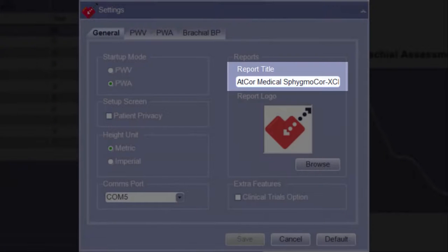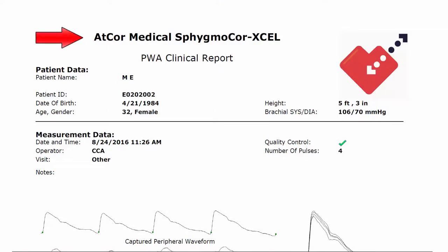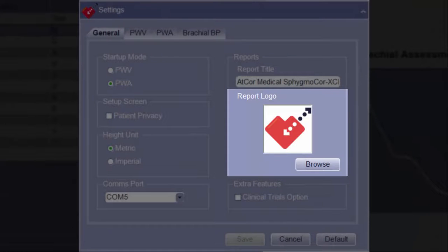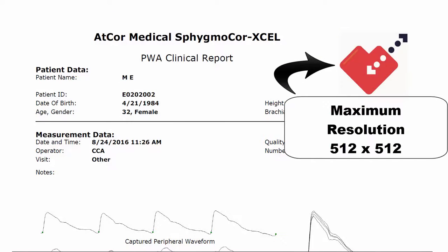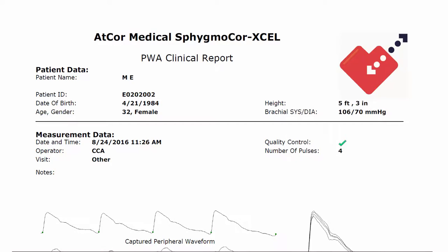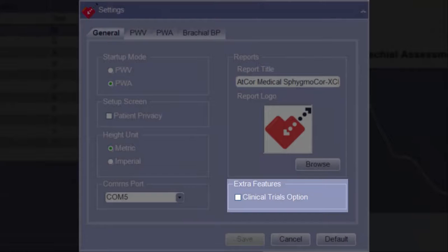Under the Reports section, the report title can be customized for printed patient reports. The title can be a maximum of 39 characters, including spaces. The Report Logo option allows for a customized logo to be placed on the top of printed reports. The maximum resolution for the logo is 512 by 512 pixels; however, any larger size logos will automatically be scaled down.